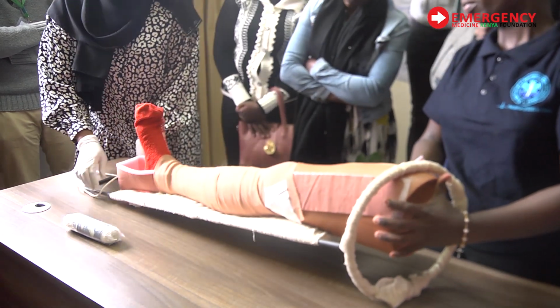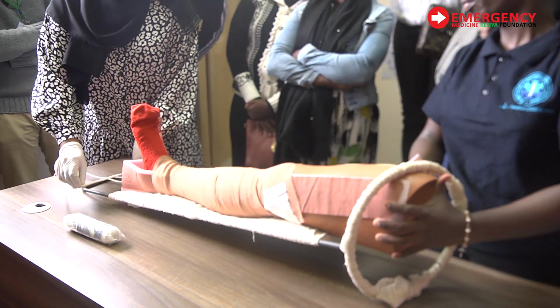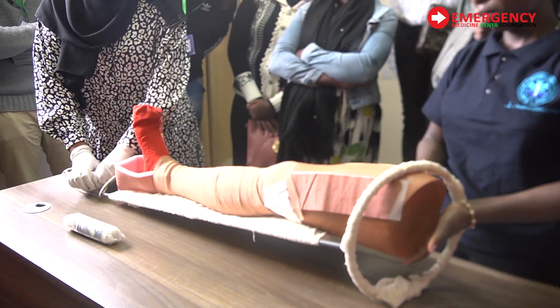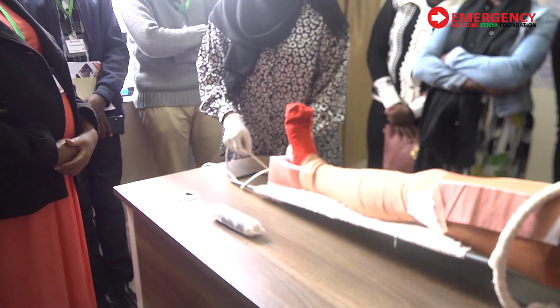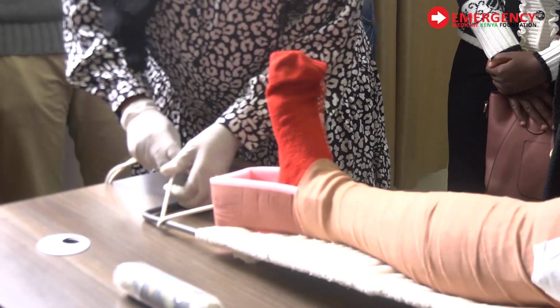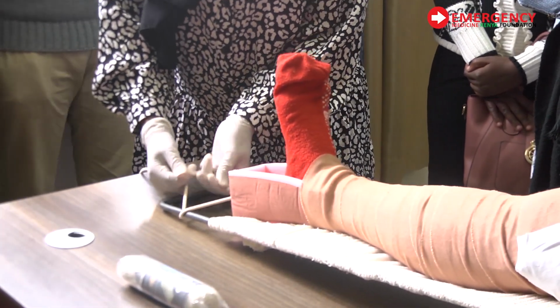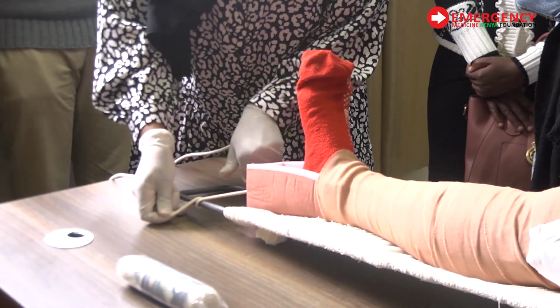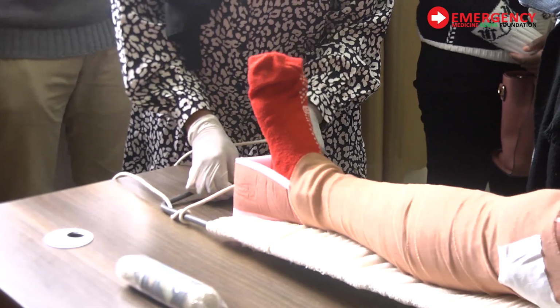So what you do, you can tie a knot here. You're not tying a knot, you're just putting this. So you have your weights. I assume we have weights. We have pulleys, right? Yeah, so you have jerry cans. Okay, it works. It still works. You get my point, yeah. As long as it works and it saves the person's life, it's not rocket science. We don't need to say, oh, we don't have pulleys, then we are not using, okay?